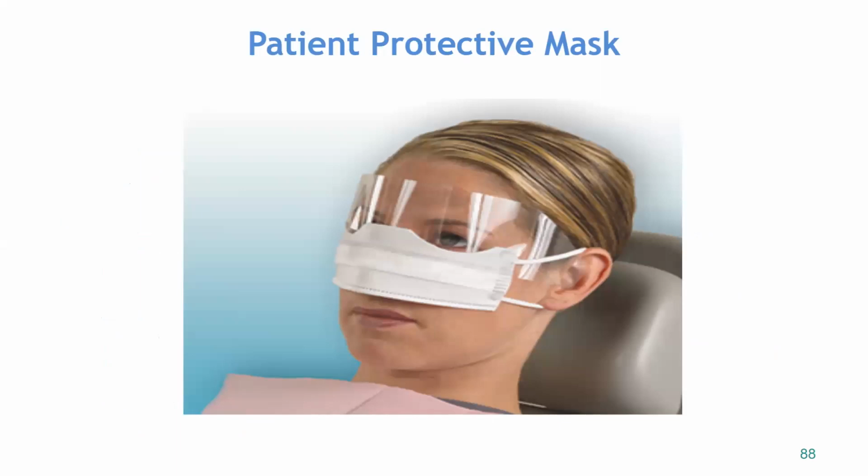So we do not have these in the clinic. Honestly, I've never, ever seen these used. This PowerPoint was the first time I've ever seen them, but they do make these for patients. This is interesting to me because it's their own aerosols, right? So it's not like it's going to get them sick. If you had aerosols left over, but a high volume evacuation suction is going to reduce like 98% of the aerosols that you create. So, but these do exist.